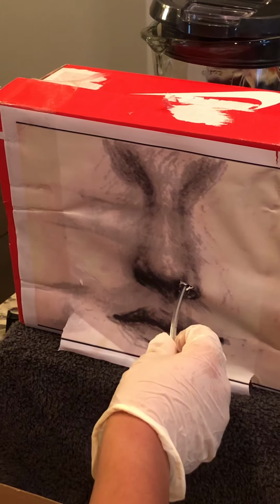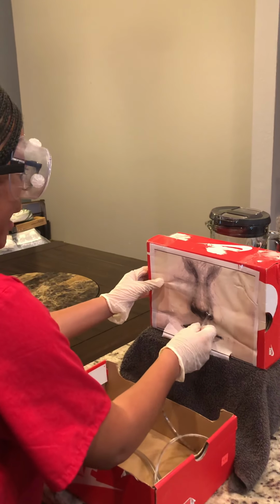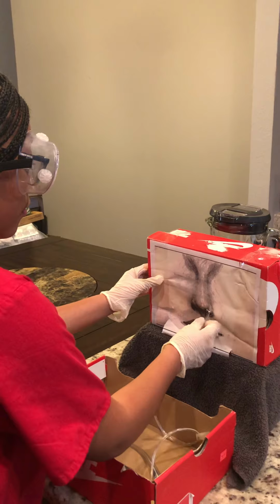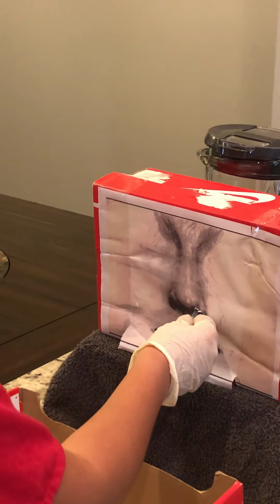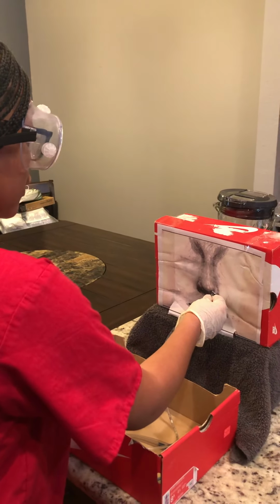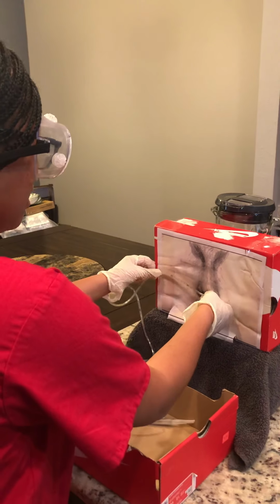I'll ask my patient to take a sip of their water or to dry swallow while advancing the tubing 1 to 2 inches at a time, rotating at 180 degrees until reaching the marked placement. Now what I will do is make sure that I do not push against any resistance or force the tubing.